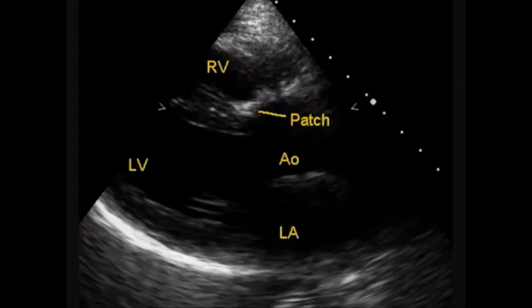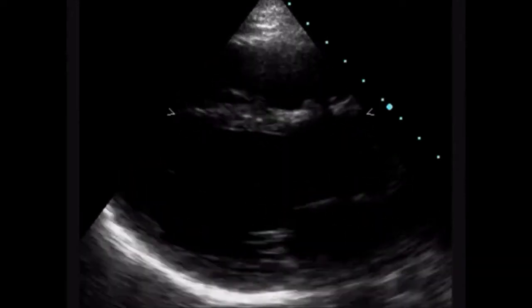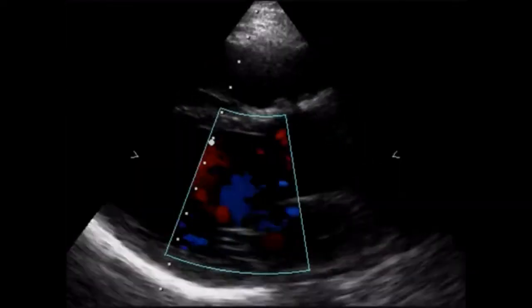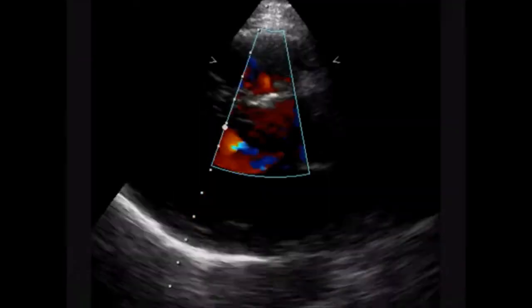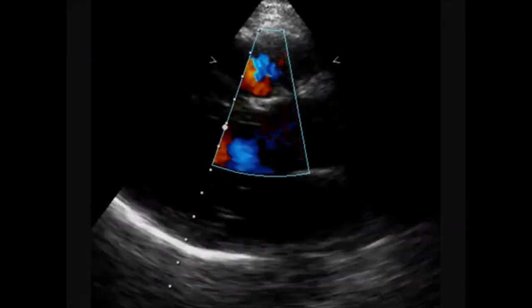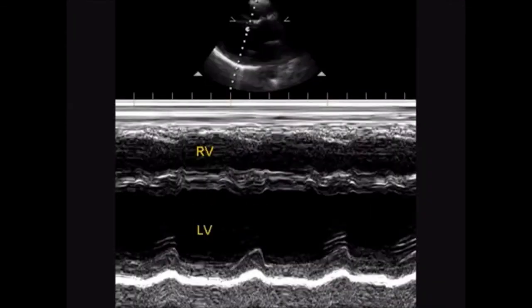Now we will see what happens after repair of Tetralogy of Fallot. You can see a dense patch in the sub-aortic region. There is no flow across the patch in this case, which means the repair has been complete. There is no residual ventricular septal defect.